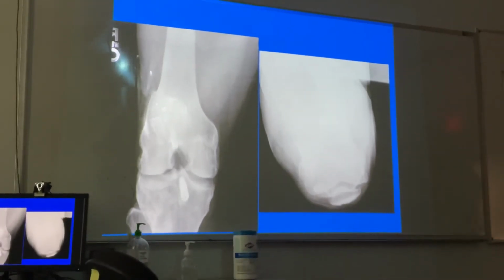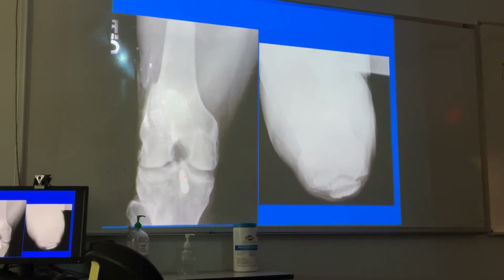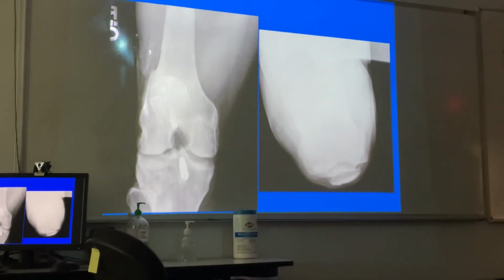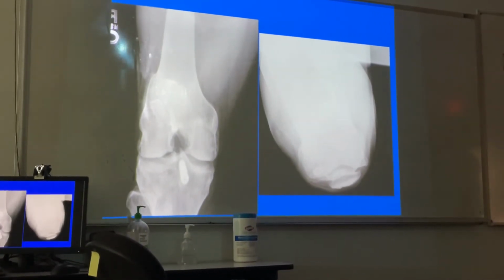Body part? The knee? Okay, in the knee, how do these densities get inside the proximal tibia and the epicondylar region? Surgery. What kind of surgery? ACL. ACL reconstruction. Jerry, give me a 5-minute discussion on what can happen to reconstructions of the knee.